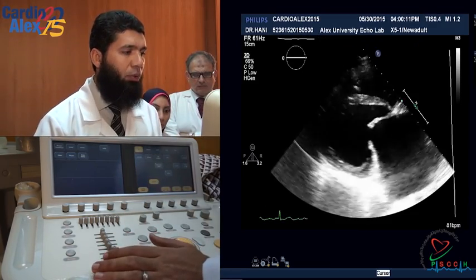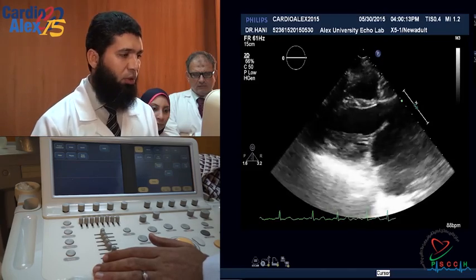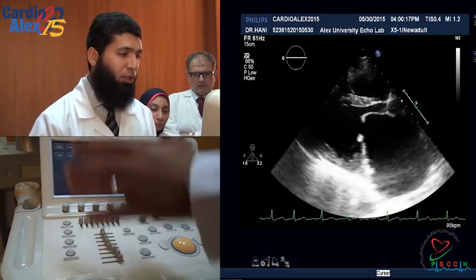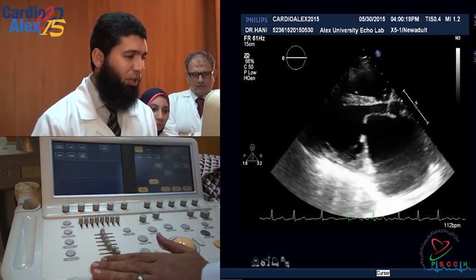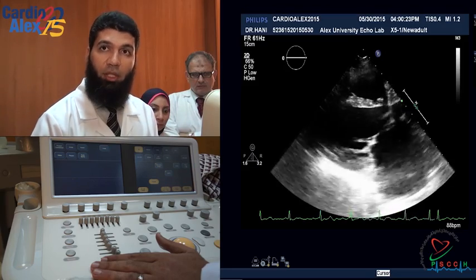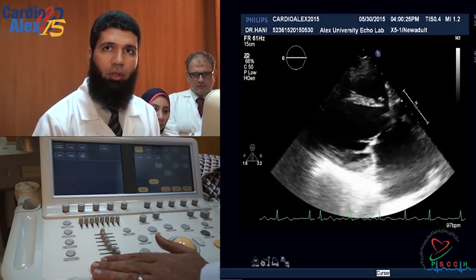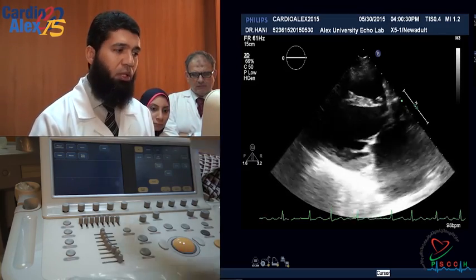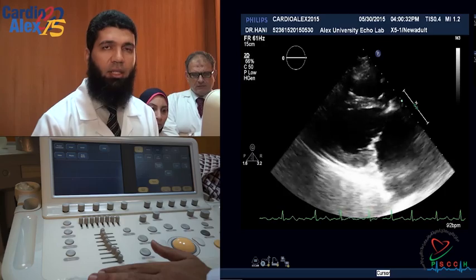Okay. Now these are the modes of acquisition. Let's go valve by valve. We'll start with the mitral valve, which is considered the son of the 3D because it's a typical valve for 3D acquisition, as it is a thick, relatively slow-moving valve, especially if the patient has rheumatic heart disease, for example. That's why we chose this case.